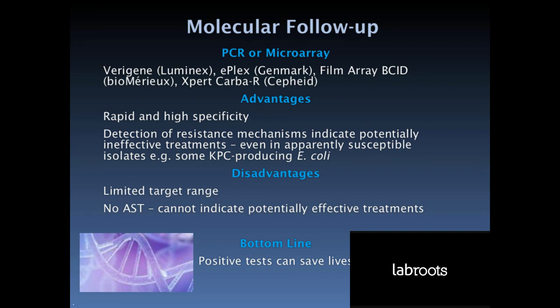In Alan's case, it was not a Verigene false positive result. At our lab, we confirmed carbapenemase production by detecting carbapenem hydrolysis, and also saw a significant increase in carbapenem MICs when tested with 100-fold higher than standard inoculum, an inoculum that might occur in a patient's infection. Another important point about detecting this isolate as a carbapenemase producer is that KPC is a transmissible carbapenemase, and therefore the isolate could have been a source of KPC transmission.